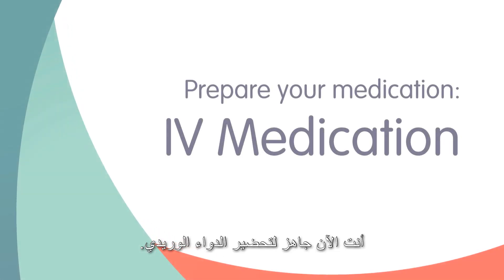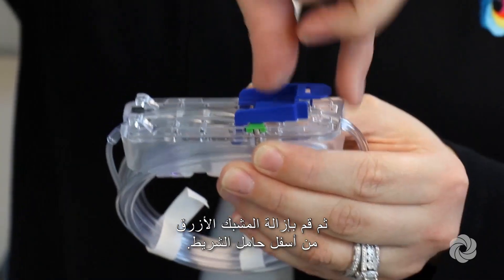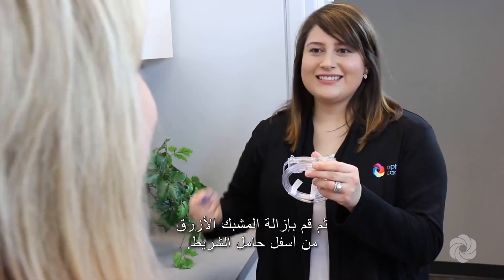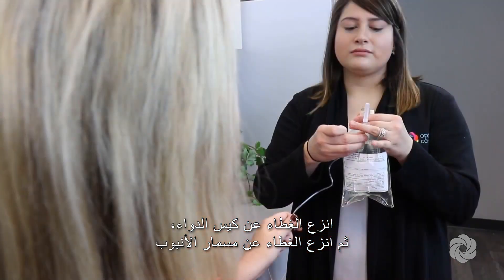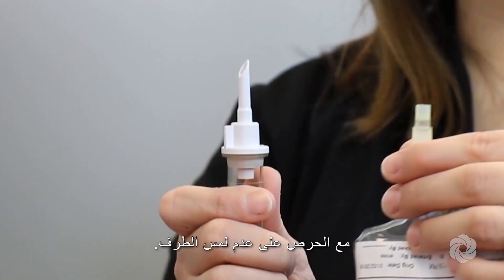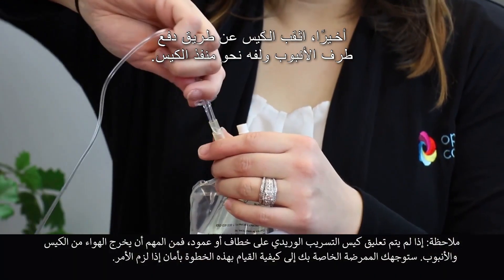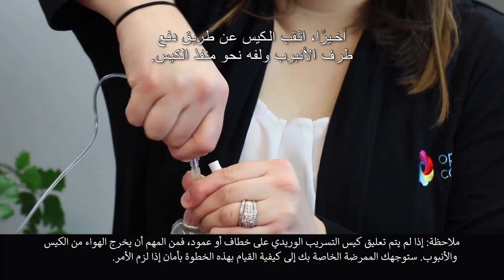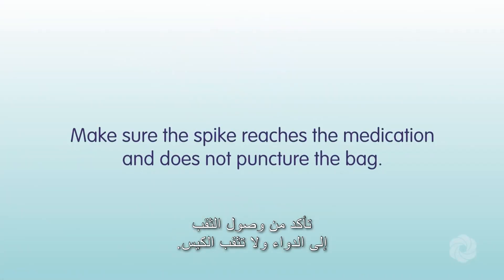You are now ready to prepare your IV medication. Remove the IV tubing from its package, then remove the blue clip from the bottom of the cassette. Remove the tab from the medication bag, then remove the cover from the spike of the tubing, being careful not to touch the end. Spike the bag by pushing and twisting the end of the tubing into the bag port, making sure the spike reaches the medication and does not puncture the bag.